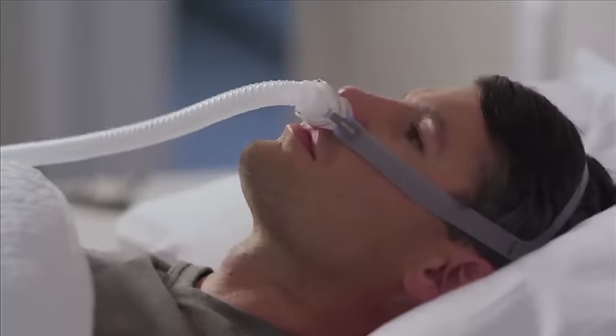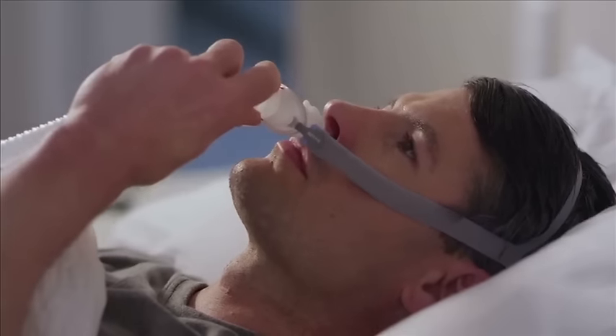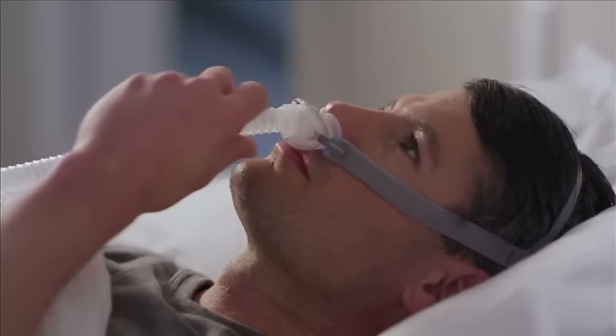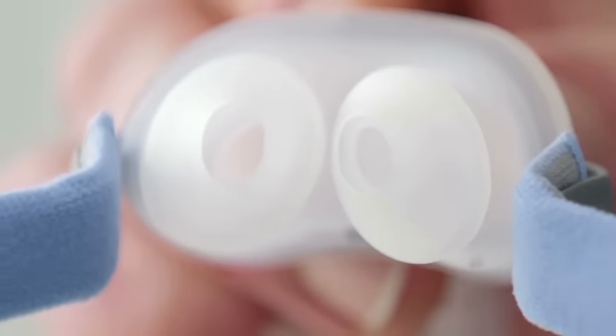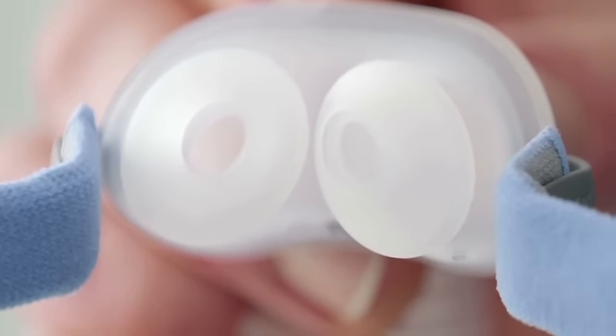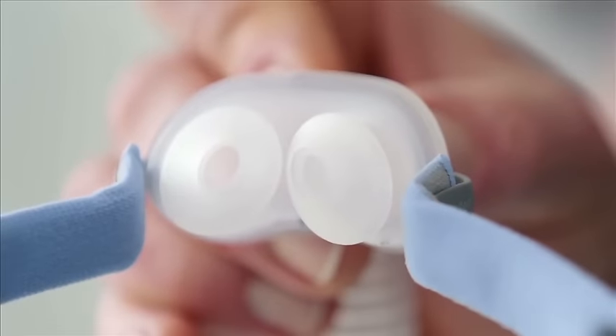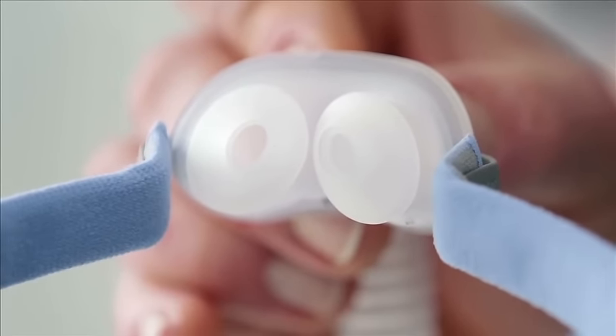If your mask is uncomfortable or leaking air, try repositioning your mask. Do this lying down, as that's how you'll be using it. If you notice that the inner wall of one or both of the pillows is slightly out of shape, compressed or collapsed, just squeeze the sides to release the pressure and it should spring back to shape.